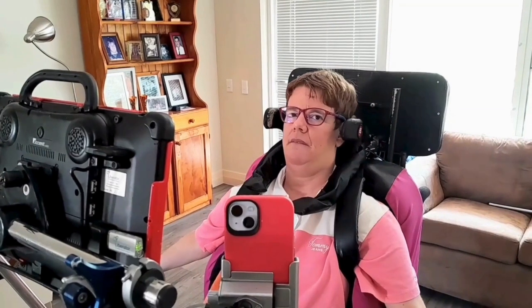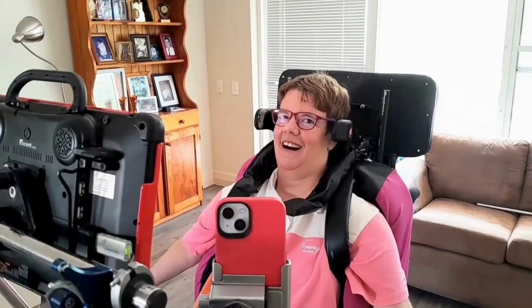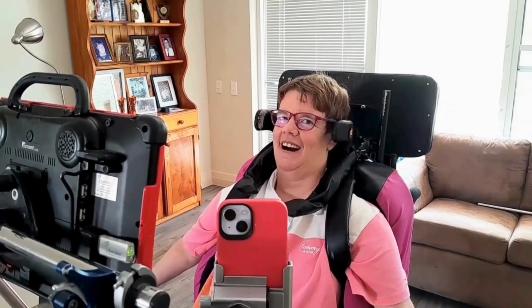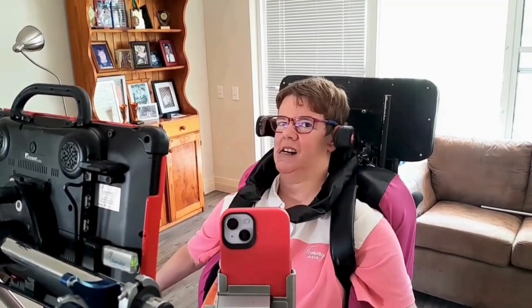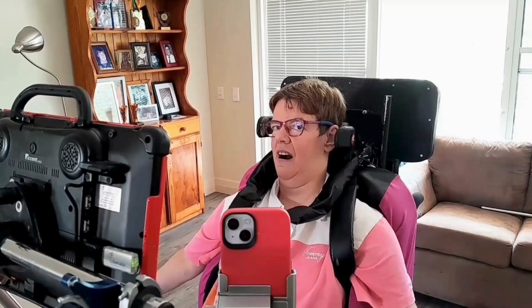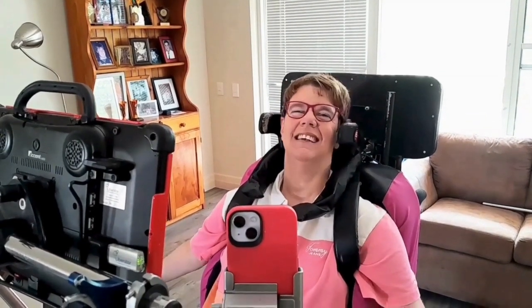I'm using a communication device called an Accent to talk, and an eyegaze system. Today, I am going to show you how I can use my off-screen keys for storing notebooks, because you may be like me, and your main Speak home page is too full.